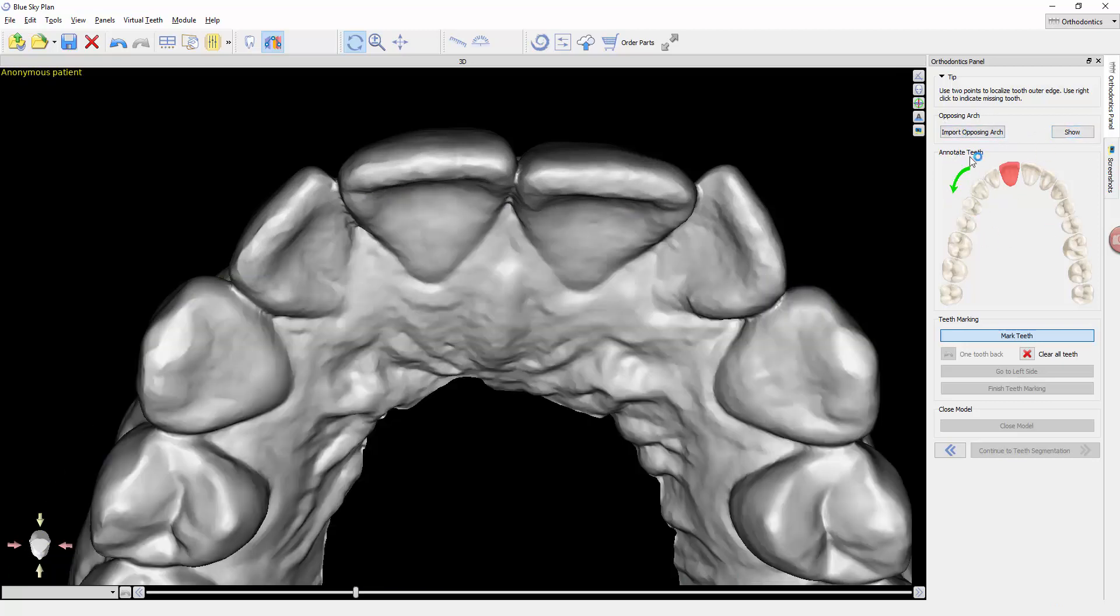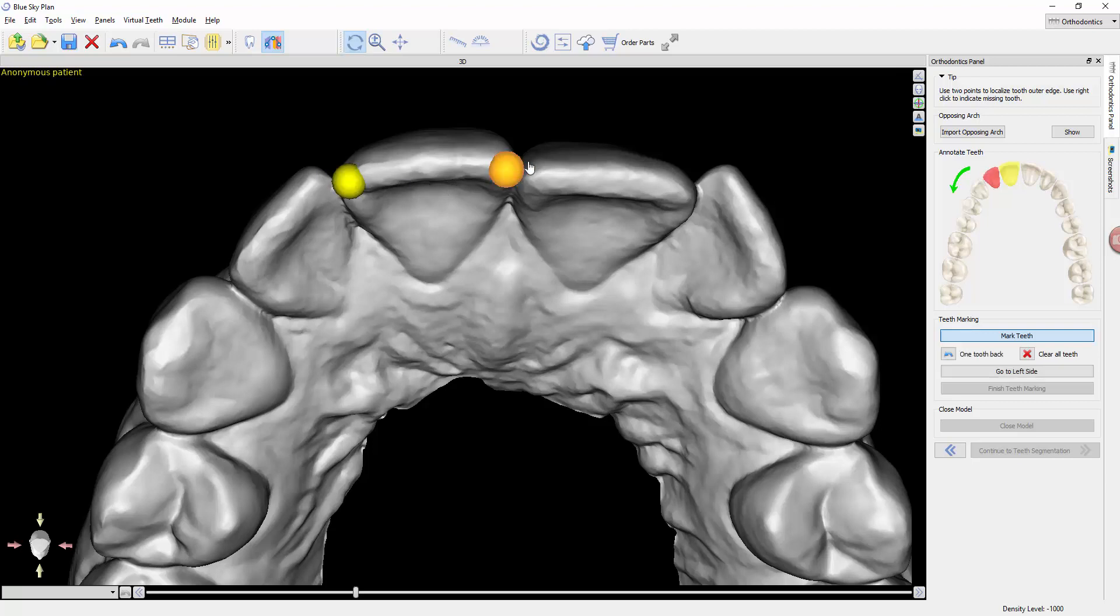It's telling us where to start, the upper right central incisor. As I hold the shift button, I can click two different times, two different color nodes. That tells the software, gives it a hint of where the mesial and distal tooth is.